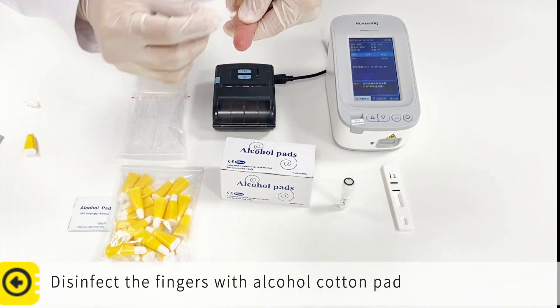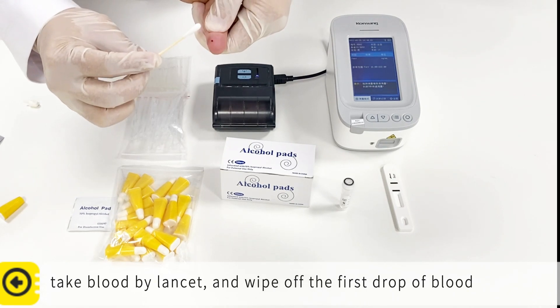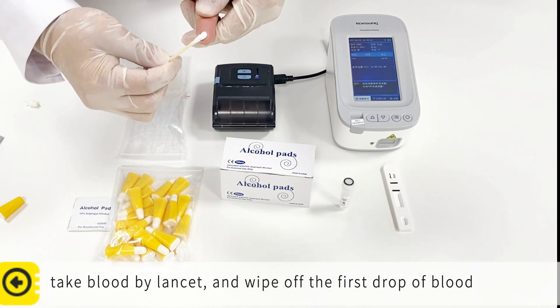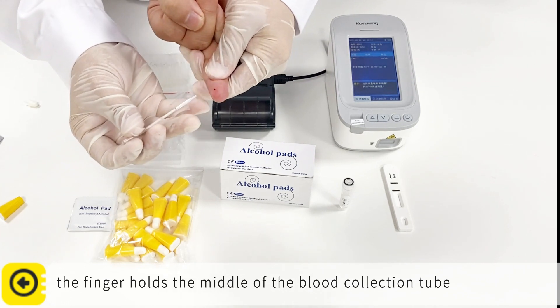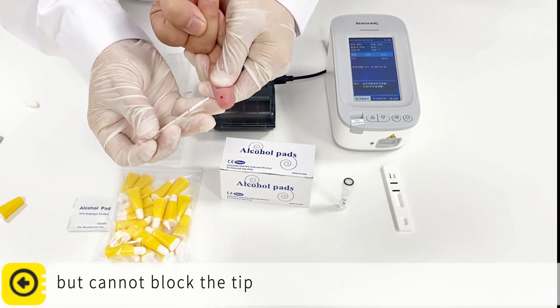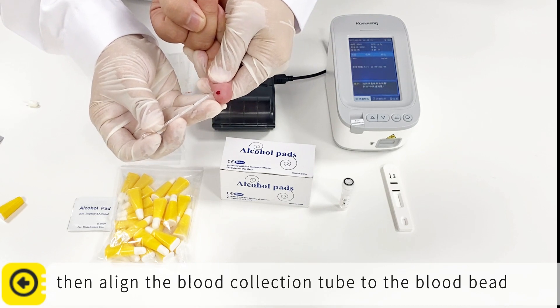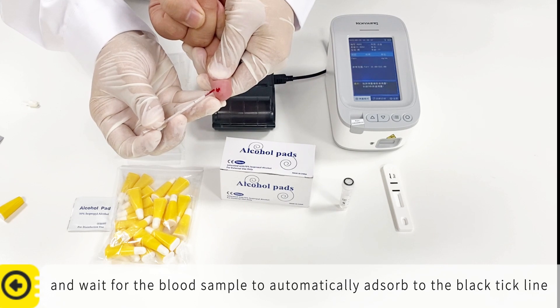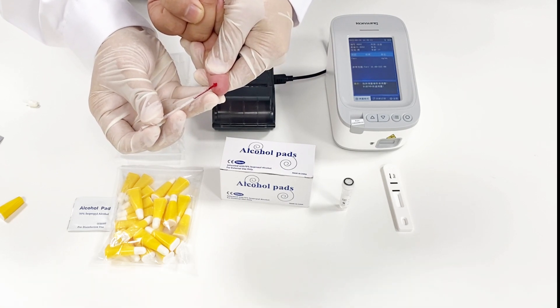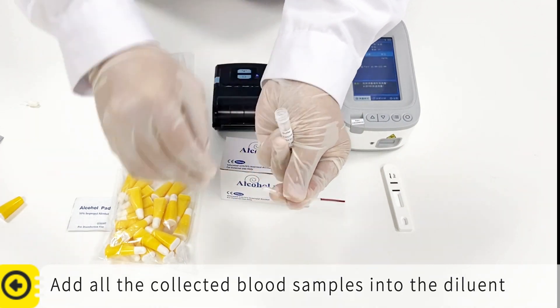Disinfect the fingers with an alcohol cotton pad. Check blood balance and wipe off the first drop of blood. After the blood bead has formed, hold the middle of the blood collection tube without blocking the tip. Line the blood collection tube to the blood bead and wait for the blood sample to automatically adsorb to the black tick line. Then stop bleeding. Add all the collected blood samples into the diluent.